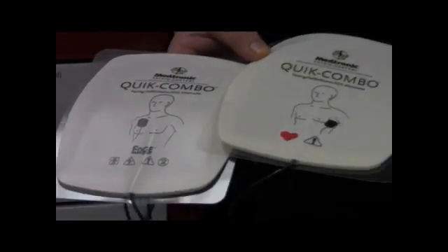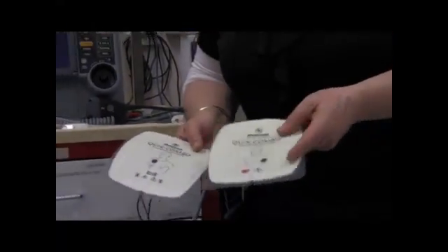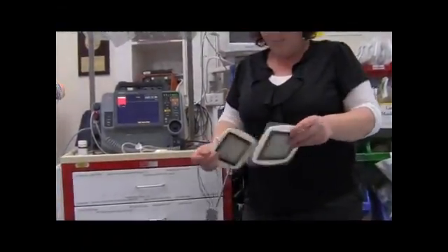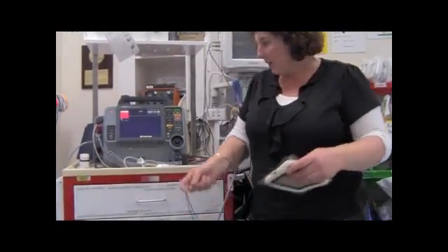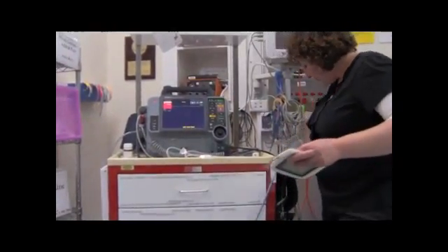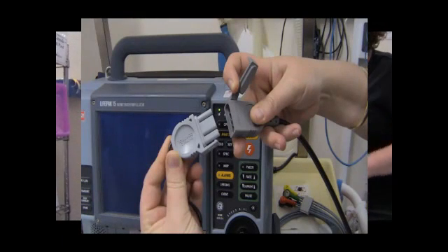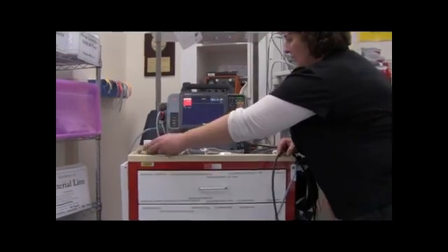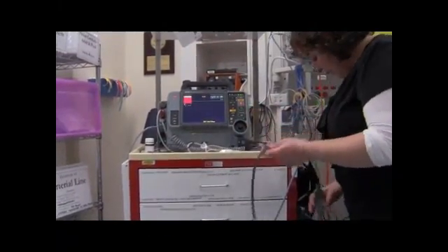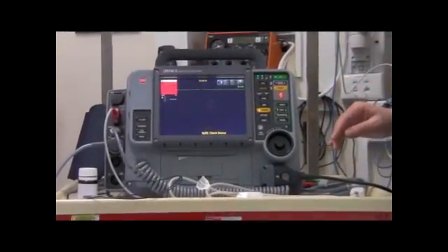This one shows you to put it on the right upper chest area, and this one goes in the left mid-axillary line basically. So you just peel off the plastic backing and you apply them in the position that it's set, and then you hook them onto the therapy cable, which only goes on one way, and then you're ready to monitor or to defibrillate the patient. As soon as you plug them into this therapy cable, it basically goes straight to monitoring the patient through the paddles.